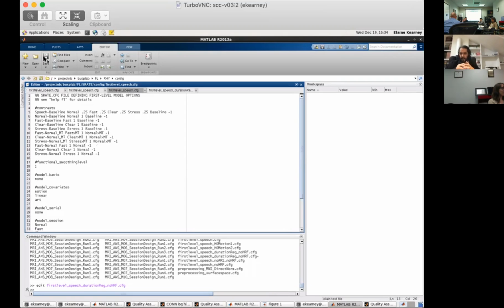I basically just repeat what I said before. But you can get that information from that, right? The flip of it is that you want to keep that in there, but it would be interesting. You could say, what are the voxels that are correlated with just duration, no matter what? That's built in here now, so we can just pull that out. And then you could say, what are the voxels that differ with duration, but to a different degree in the two tasks? That's what this would get you.